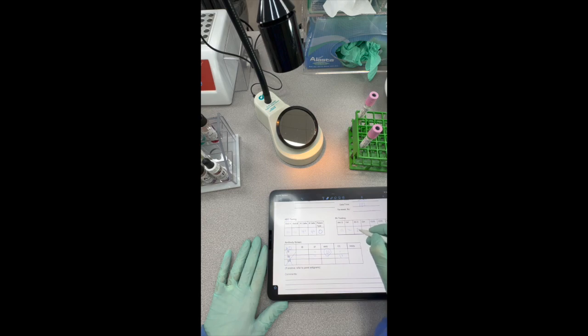So we're going to put a 2+ in there. Our control was not tested. We didn't need that for our weak D tube. Now for our D control, that was negative, remained negative, and then we got a 2+ for that control. These are the check cells here. That C is our check cells.